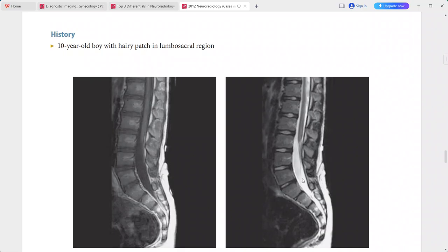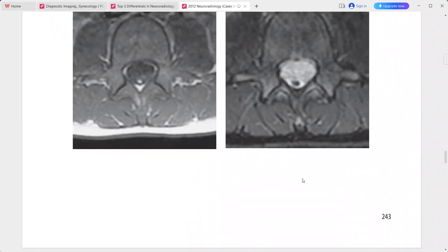This is a case of dorsal dermal sinus. In the differentials, you can include sacrococcygeal dimple.